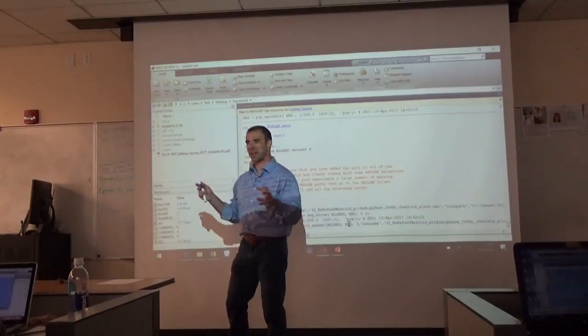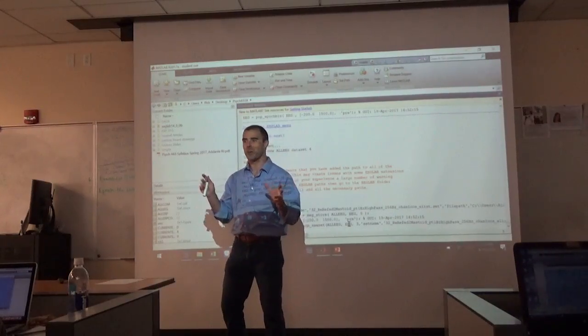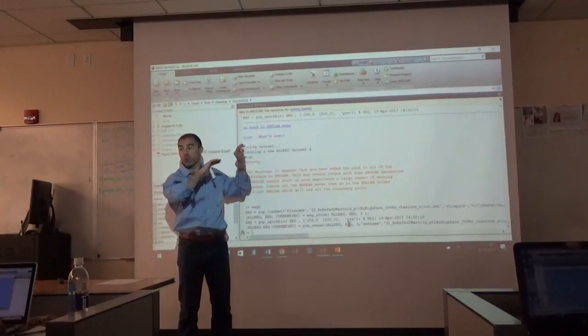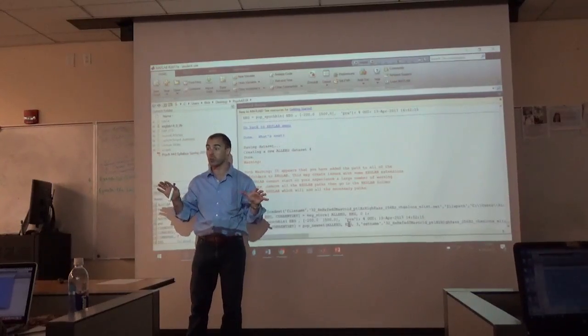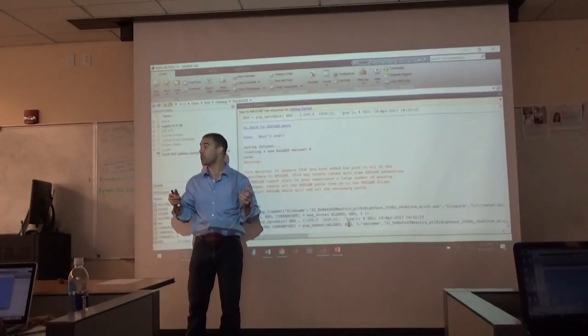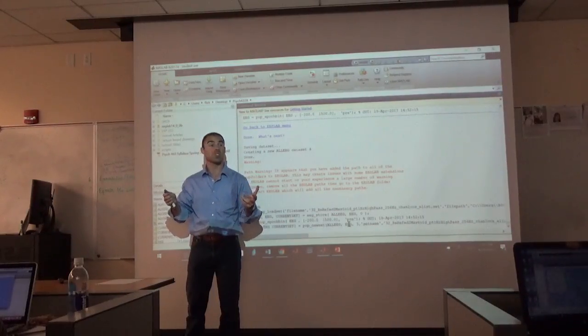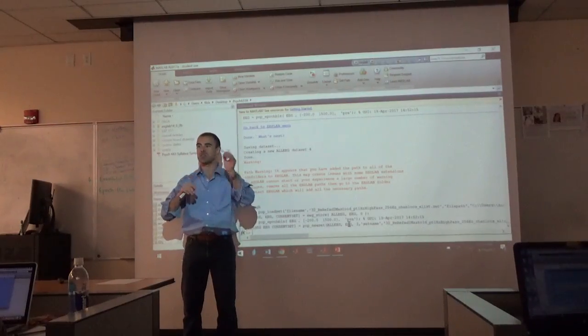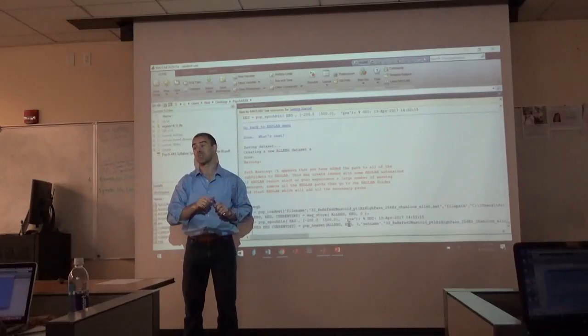We'll come back to that maybe in a couple of weeks, and we'll learn how to program in that scripting language. Once you get used to doing this by hand and working through it, which is a really easy and good way to learn, once you do that for a bunch of subjects, you're going to get really spoiled and be like, oh my god, this takes so long to click through, and we're going to be able to write it up in a script and just zip them all through. It's going to be awesome.